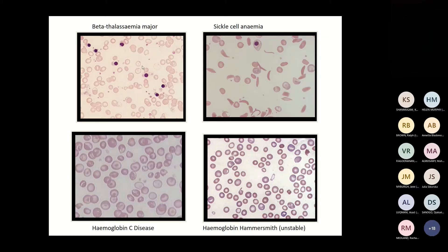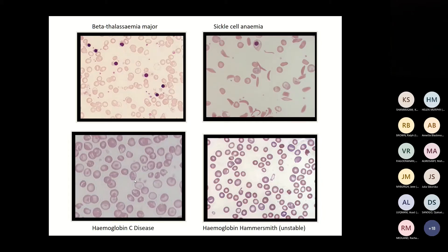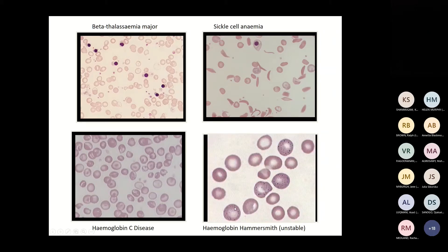In beta thalassaemia major the blood film shows microcytic hypochromic red cells with many NRBCs. In sickle cell anaemia we see sickle cells, polychromasia, and irregularly contracted cells. Haemoglobin C shows many target cells and sometimes C crystals. Haemoglobin Hammersmith, an unstable haemoglobin, shows polychromasia, tiny spherocytes, and basophilic stippling.